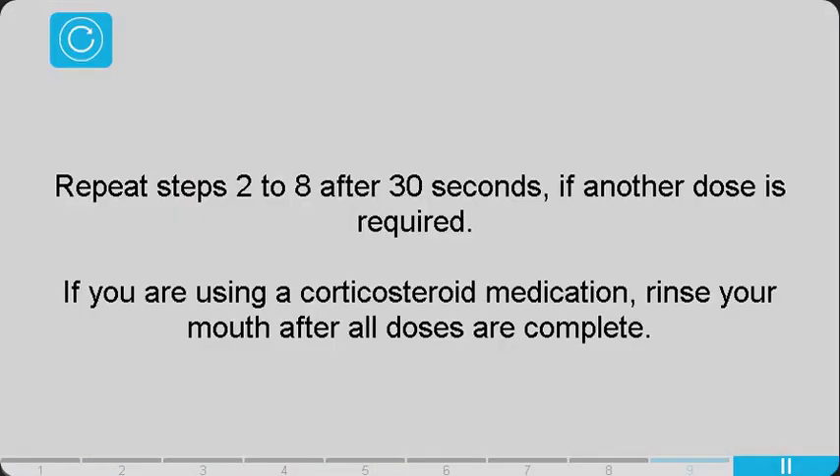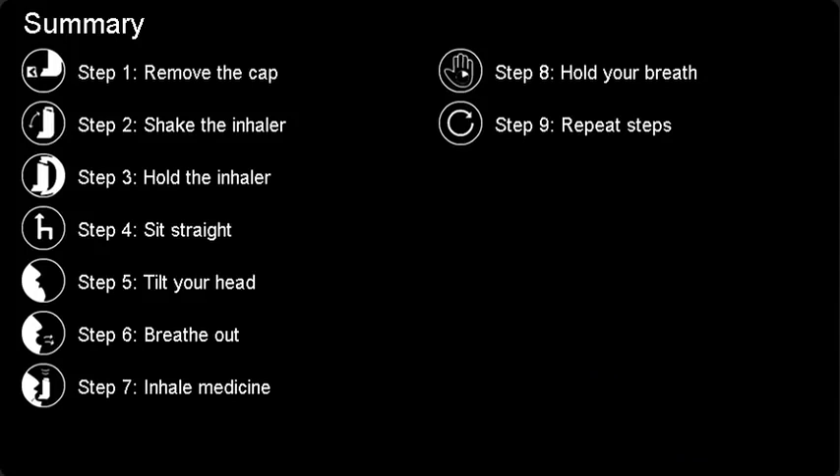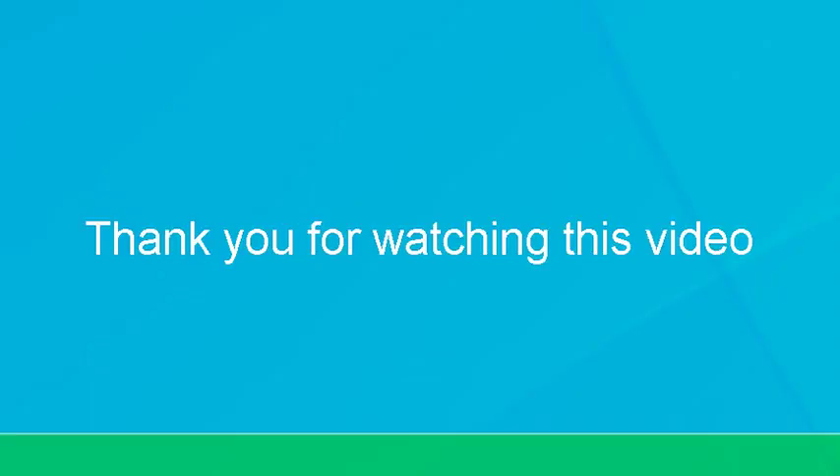Repeat steps 2 through 8 after 30 seconds if another dose is required. If you are using a corticosteroid medication, rinse your mouth after all doses are complete.